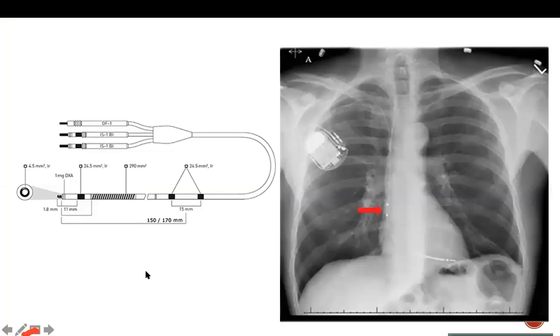Okay, so what is the difference between a pacemaker and an ICD? This image has something that might tell you the difference. The shock coil. So on the side of the can, and then the lead, the shock coil is right.